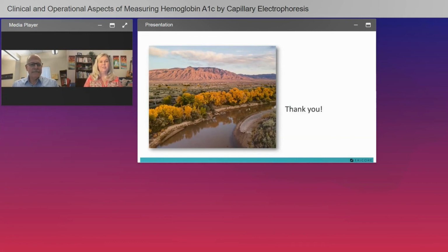Thank you so much. And I want to thank our audience for these great questions that are coming in. Dr. Grenache, do you send out the HGBF or have an analyzer to run that? Well, I'm not quite sure I understand the question. When hemoglobin F is detected in a hemoglobin A1c measurement, we don't report that. As long as it's less than the threshold, if hemoglobin F is less than I think 23, then we can still report the A1c. If it's greater than that, then we usually indicate that hemoglobin electrophoresis might be warranted. And if the clinician orders hemoglobin electrophoresis, and hemoglobin F is present, then that's something that we do report quantitatively.